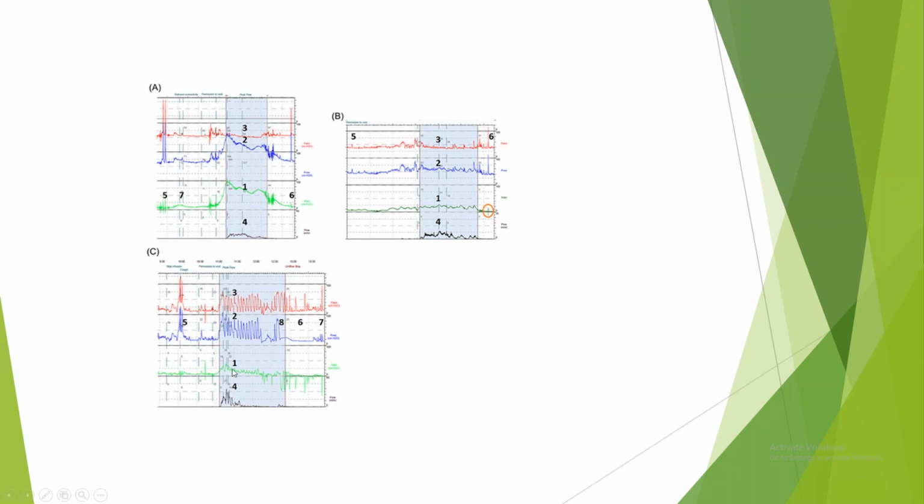Here detrusor pressure is not rising, but still we can't tell, because she is doing repeated Valsalva, which could be because of obstruction also. It will be clearer with her EMG. There is a fourth component, EMG, which will usually be there, but we are not here to interpret the EMG.